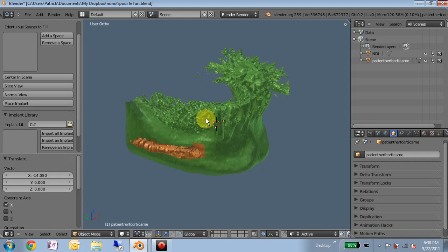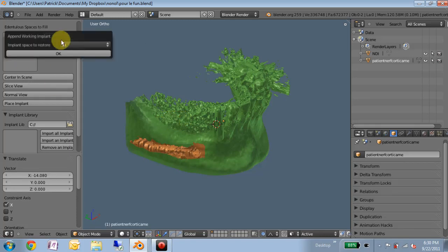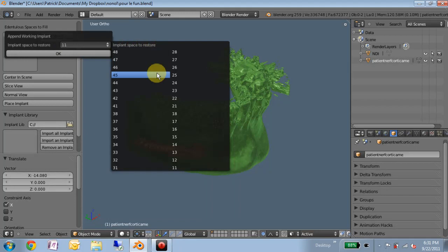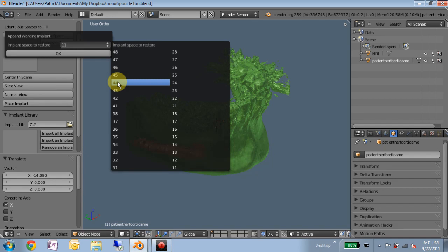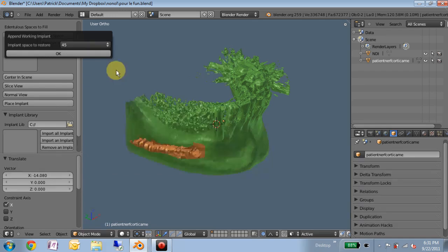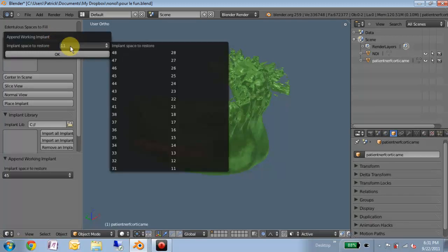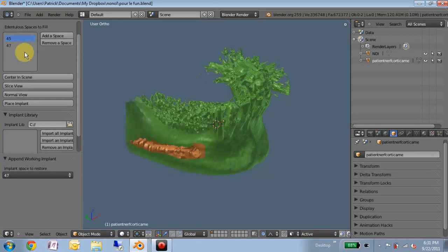If we just take this as an example, let's assume we're going to place two implants here in the fourth quadrant, maybe in the five and seven. So we'll add a space to fill, call it four-five, and then maybe four-seven. These are just as proof of concepts.